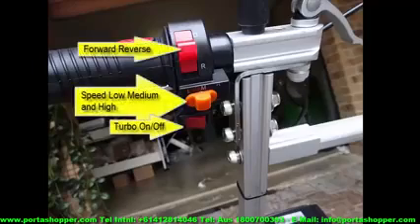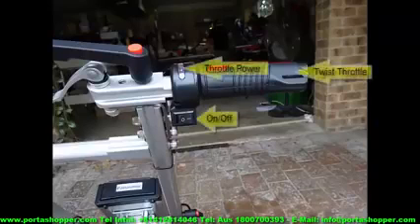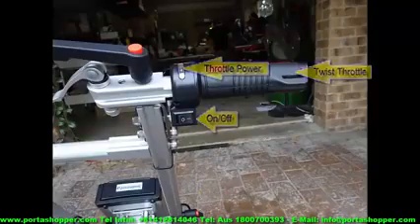So here I just want to show you the controls quickly. On the left hand side you have the forward reverse switch, the low, high and medium speed switch, and then the turbo or overdrive switch at the bottom. On the right hand side we have the twist throttle like that of a motorbike, the throttle power indicator and the on-off switch at the bottom.